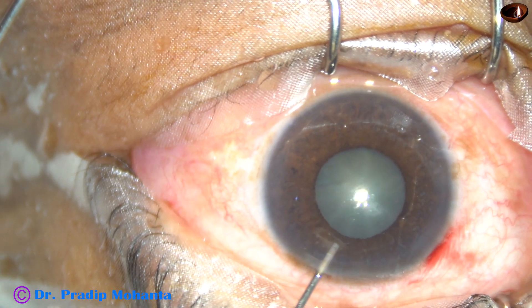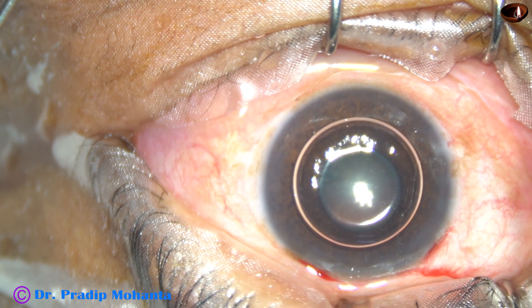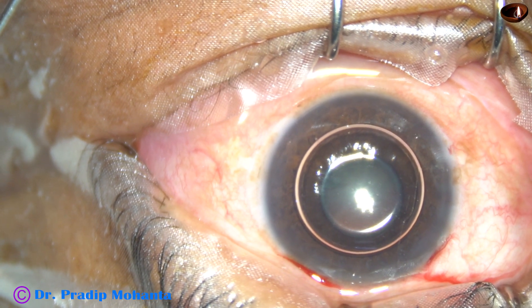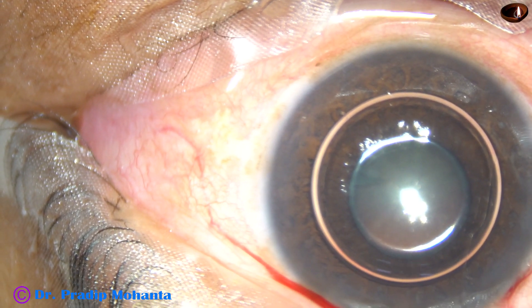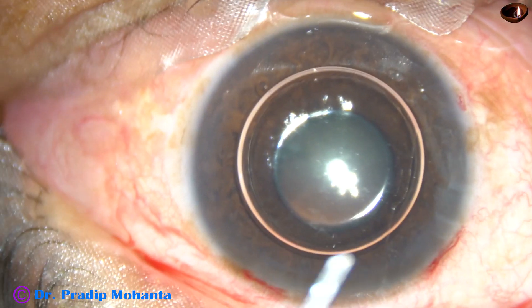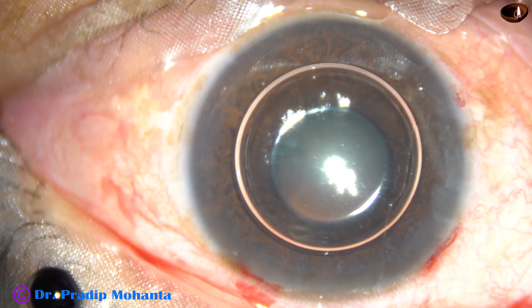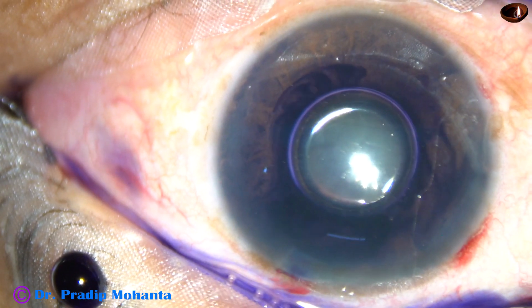This is an air bubble. I want to stain the anterior capsule with trypan blue dye underneath this air bubble. This is a totally unedited recording and you are going to watch each and every step of the surgery in real time. This is trypan blue dye.